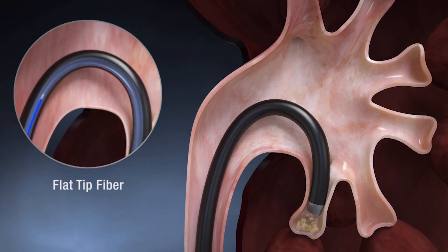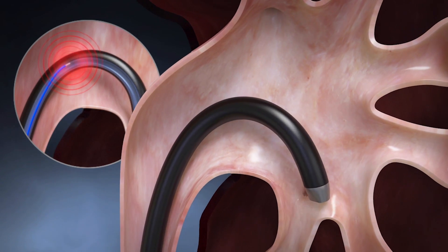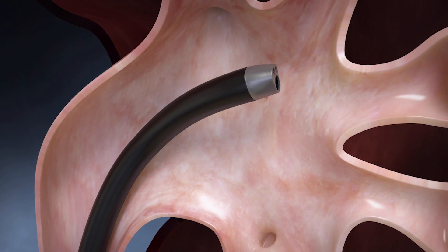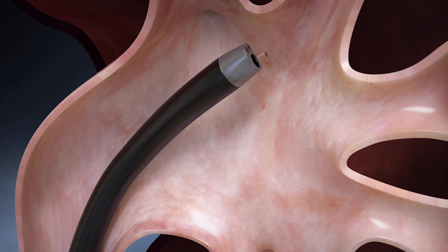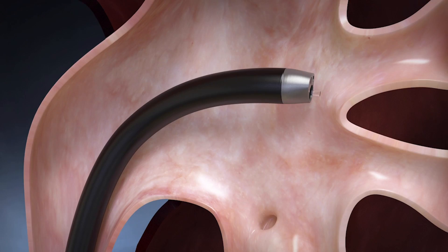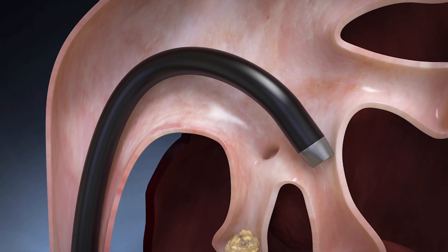Flat tip fibers can puncture the inner lining of a deflected scope, resulting in costly scope damage. To minimize potential for damage, the ureteroscope must be straightened before passing a fiber, increasing procedure time with additional steps and requiring the physician to re-access challenging stone locations.